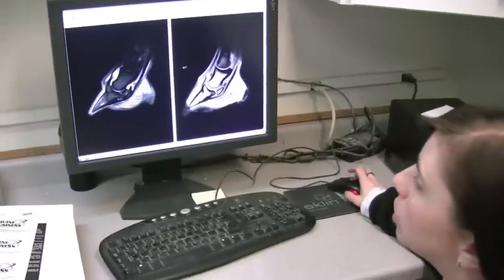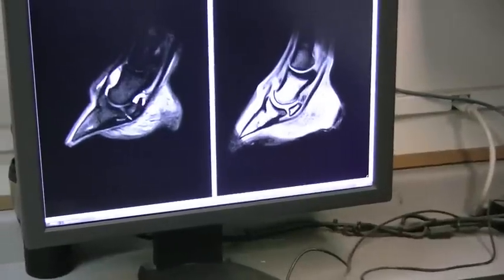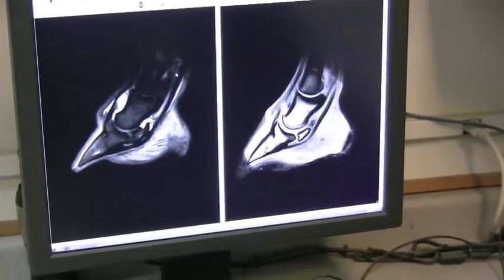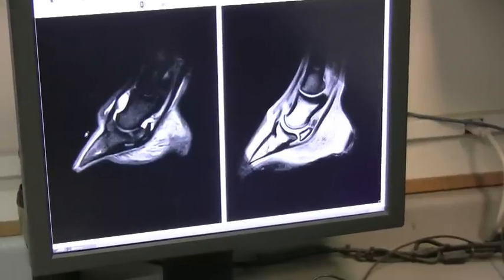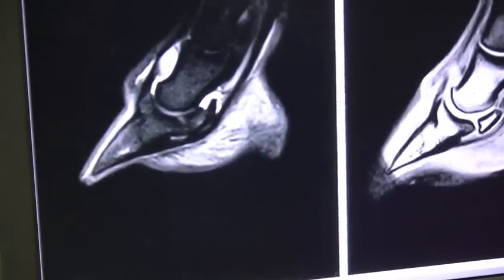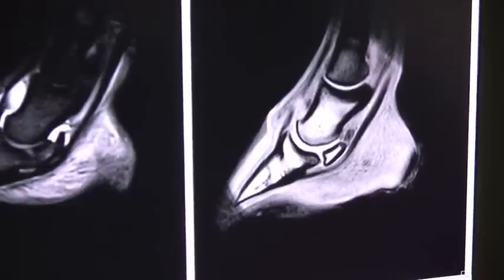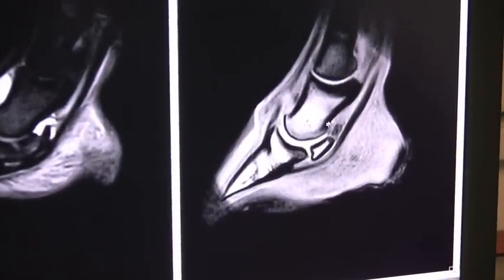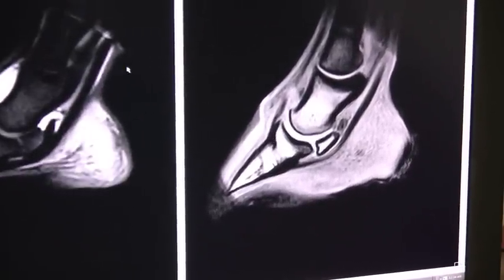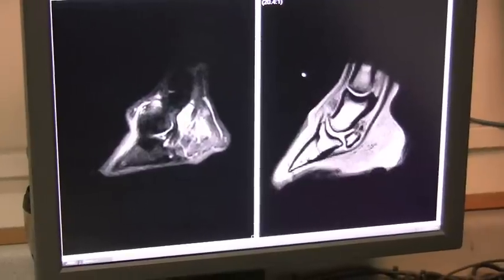These are MRI images of the front foot of a horse. We have some concerns about the navicular bone and the navicular region. These are two different types of scans, which allow us to focus on different types of tissue. This scan has been treated with a particular sequence, allowing us to focus specifically on fluid, so we're looking for bright white areas. This other scan is more of an anatomical type, so we're looking at the appearance of the bone, looking for changes within our tendon. And we can click through and evaluate each sequence depending on what we're looking for.